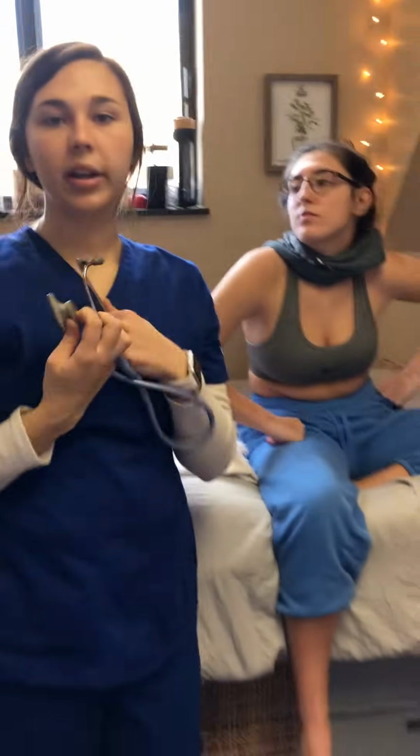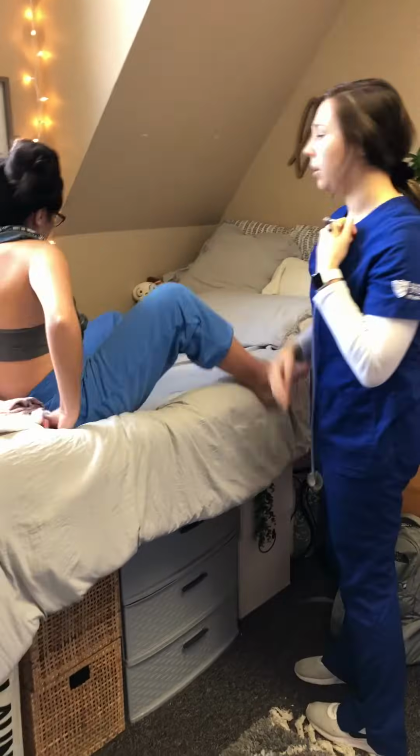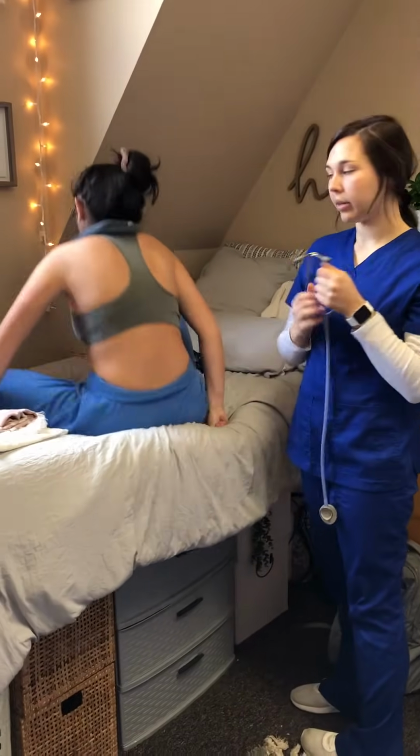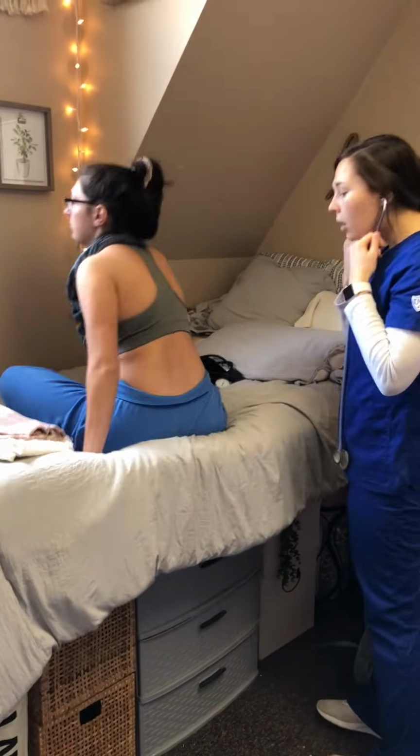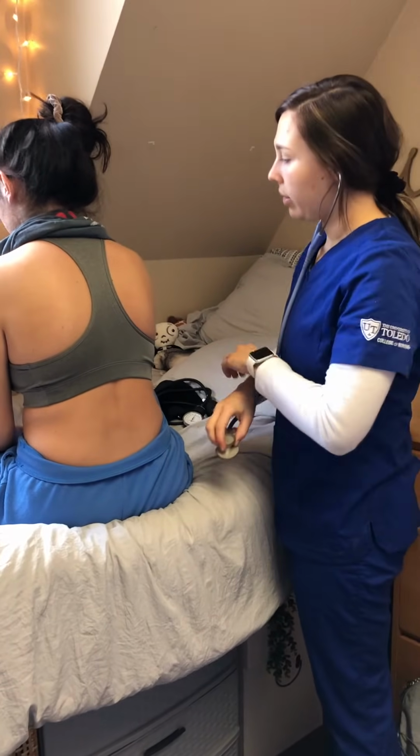So her lung sounds were clear bilaterally and through all lung fields on the anterior side. So now I'll have her turn around and I'll do the posterior. So again, every time I move my stethoscope, I'll have you take a deep breath.